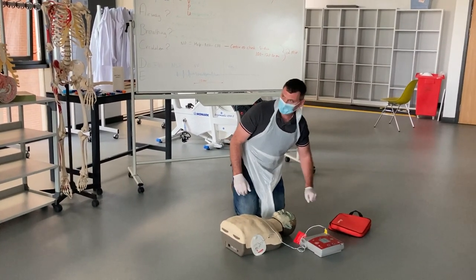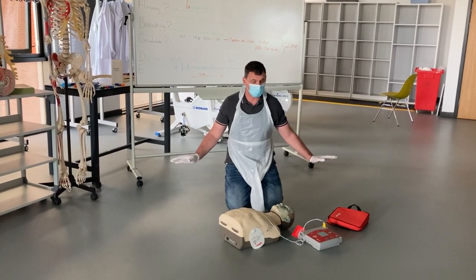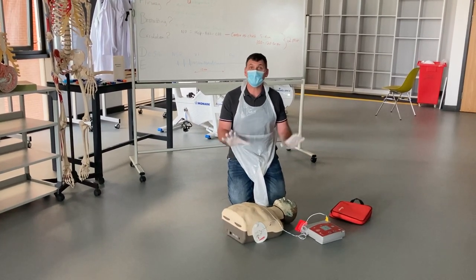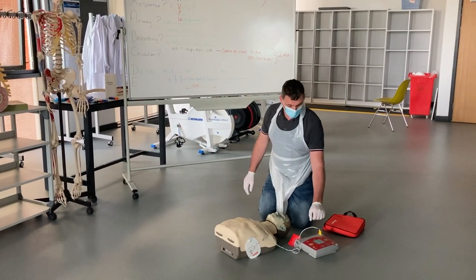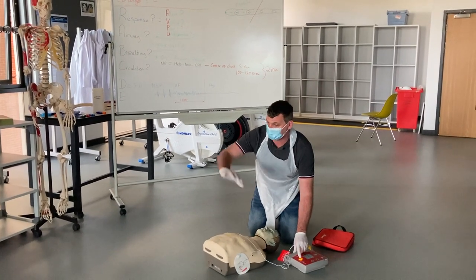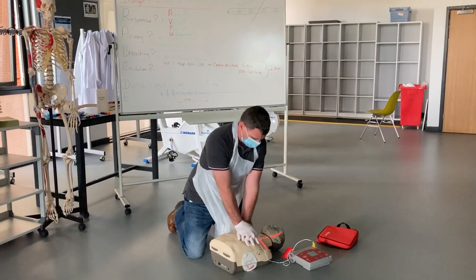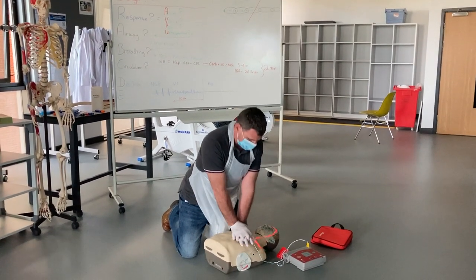The AED is analyzing the heart rhythm — do not touch the patient. The machine indicates a shockable rhythm, meaning they're in VF. I wait for the light, check that everyone is clear — top, middle, bottom — and deliver the shock. The body will shake. I'm now going to start chest compressions and keep this going for two minutes.